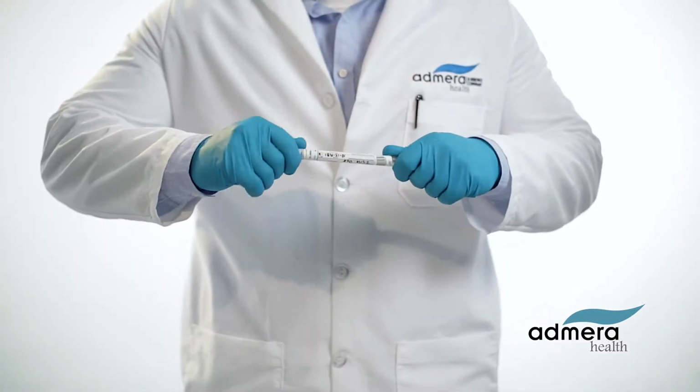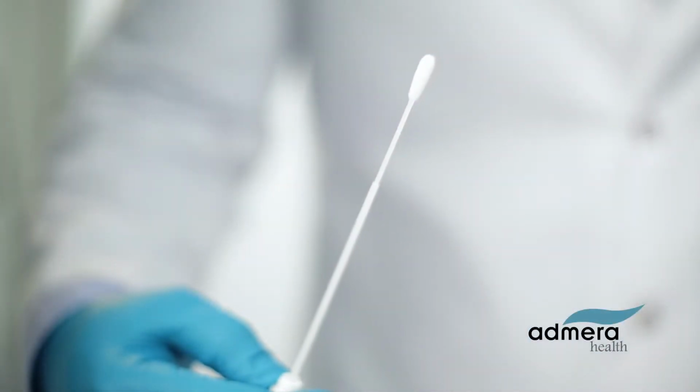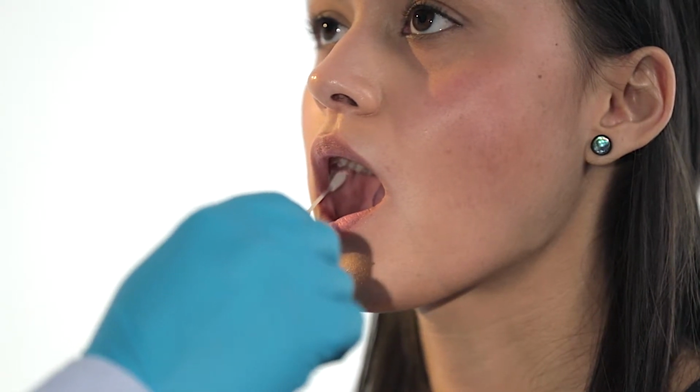Twist off and gently pull the cap to separate the buccal swab from the clear plastic tube. Take caution not to touch the swab head with your hands or fingers during this process. Hold the swab firmly and place it in the patient's mouth against the inside of his or her right cheek.